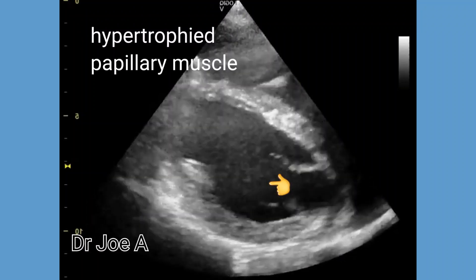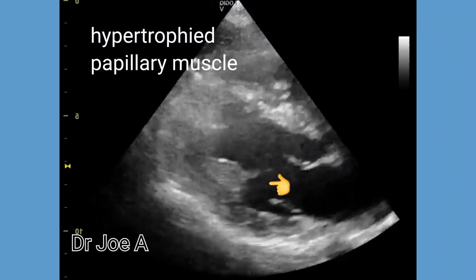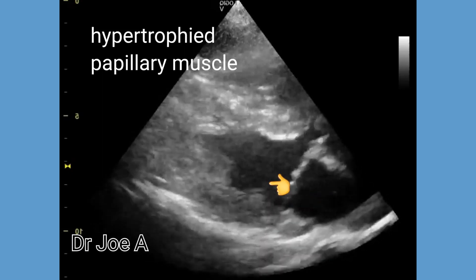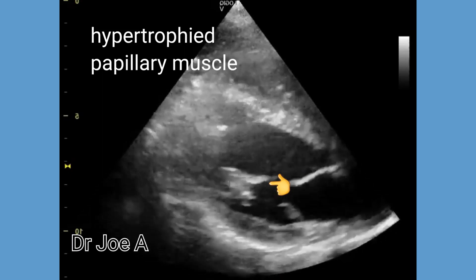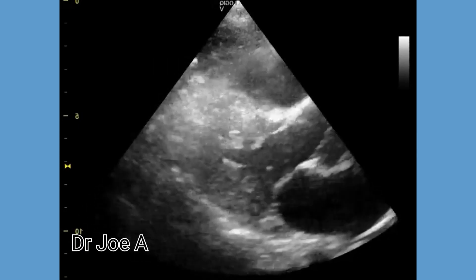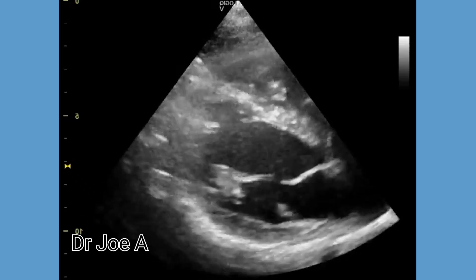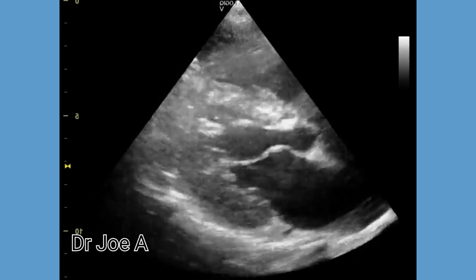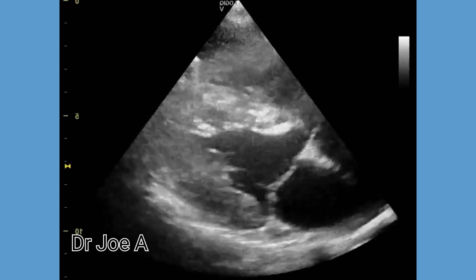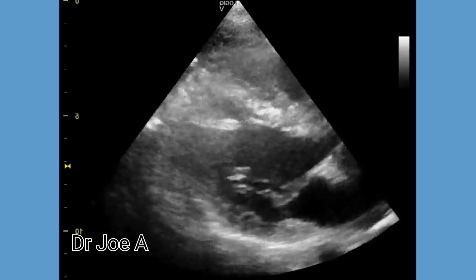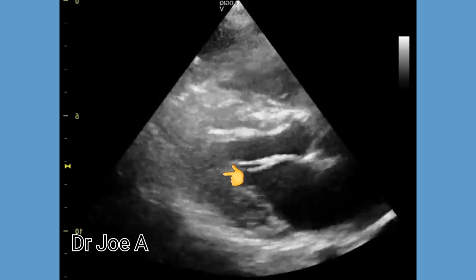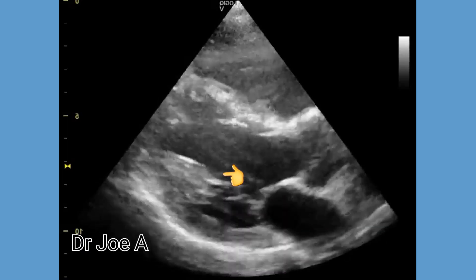There are two papillary muscles in the left ventricle. In this patient, the posteromedial papillary muscle appears to be very prominent — this is what is known as a hypertrophied papillary muscle. The mitral valve leaflets of the left ventricle are attached to the papillary muscles via the chordae tendineae. The chordae tendineae and the papillary muscles prevent eversion of the mitral valve leaflets during systole.